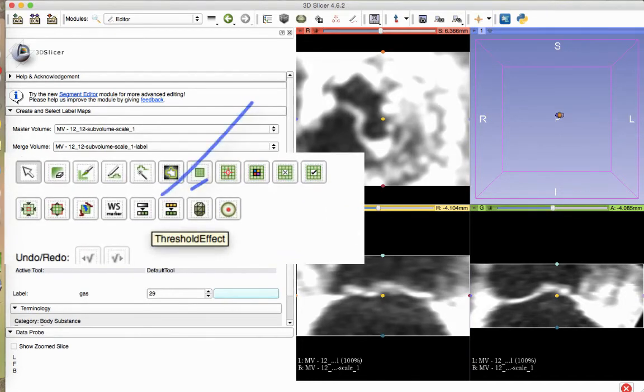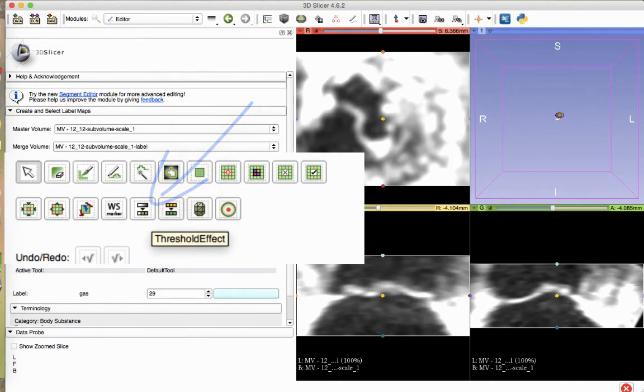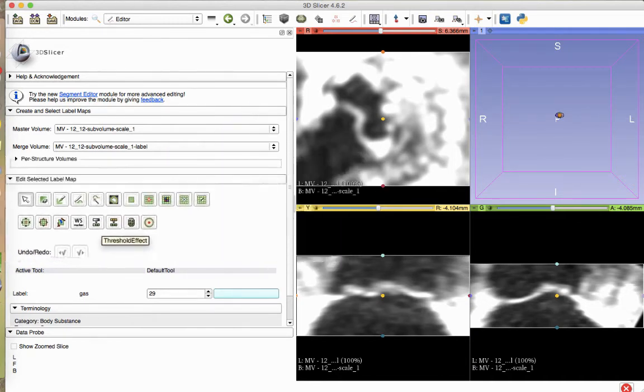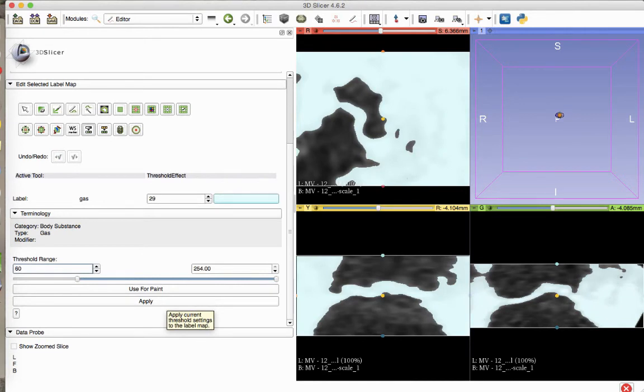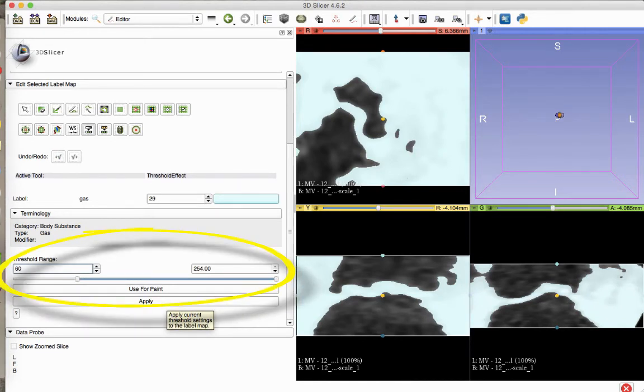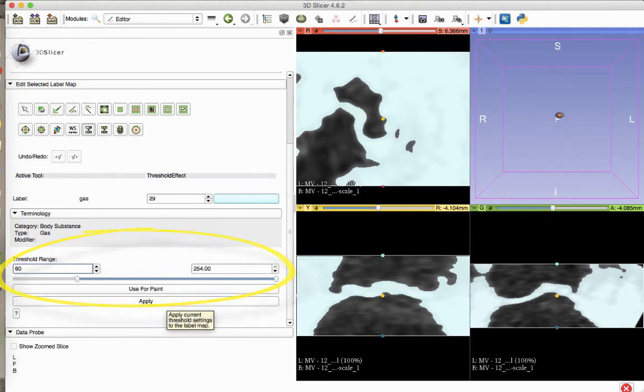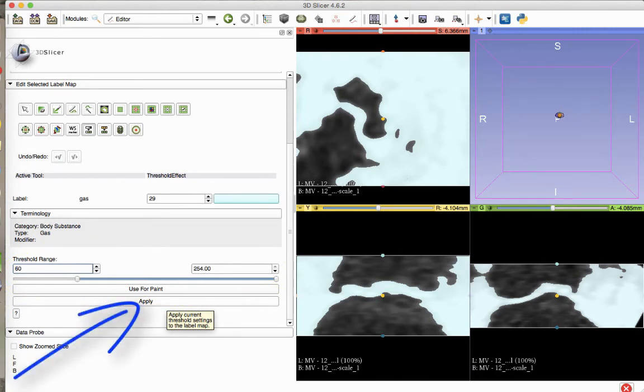It is the fifth button on the second row of buttons in the Edit Selected Label Map section of the module. You will see the areas of the volume that fall in the default threshold range light up in the color of the selected label. Scroll down in the module to modify the threshold range. By changing the lower value, any region below the selected number will be excluded from the print. When you are satisfied, click Apply.